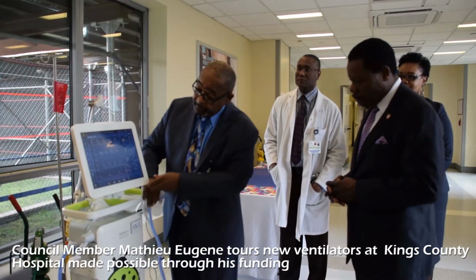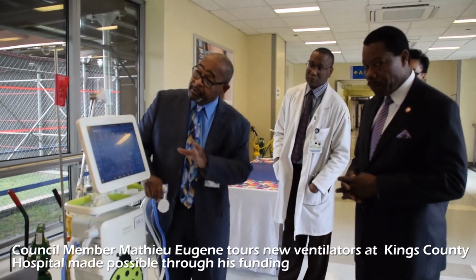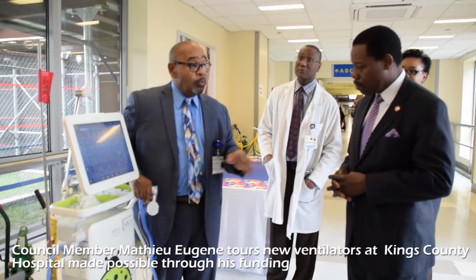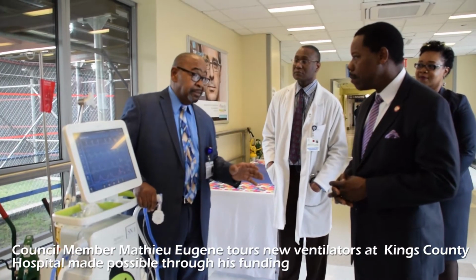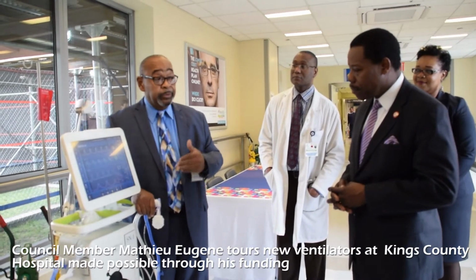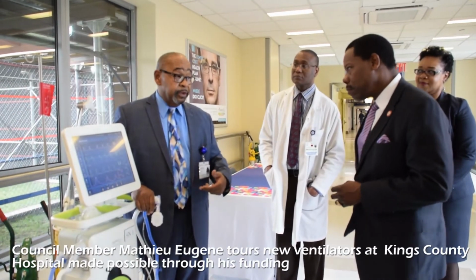The other thing you see here is another key differentiator. Without going into much detail, it's called NAVA. NAVA is neurally adjusted ventilatory assist. A lot of times, the machine is not working with the baby. The baby's doing one thing, the machine's doing something else. What NAVA does is allow the baby to control the ventilator using the electrical signal from their diaphragm.